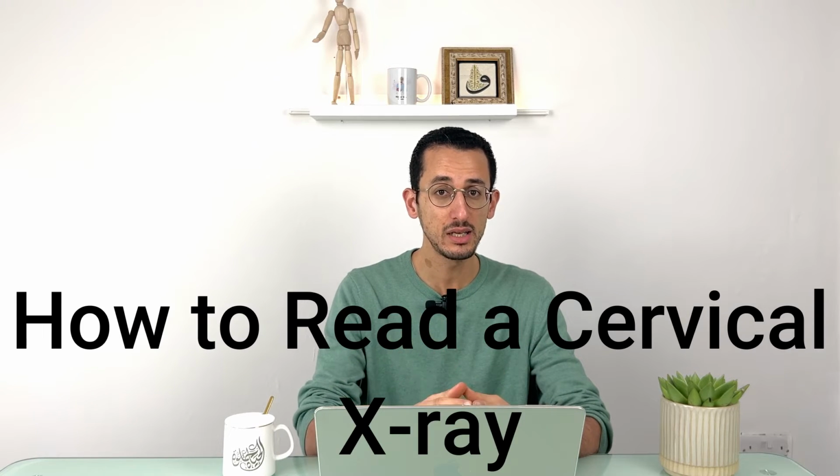Cervical fractures are common in traumatic patients, and X-ray is a common imaging modality that you will see in a lot of trauma patients. In this video, we'll go through the normal cervical anatomy in a cervical X-ray and how to interpret this imaging.